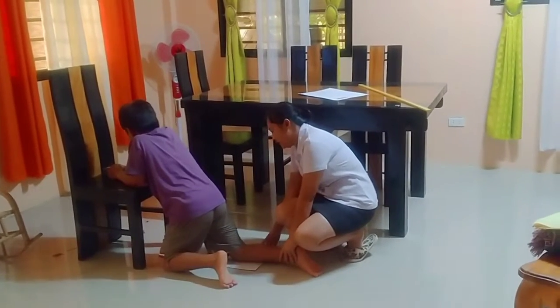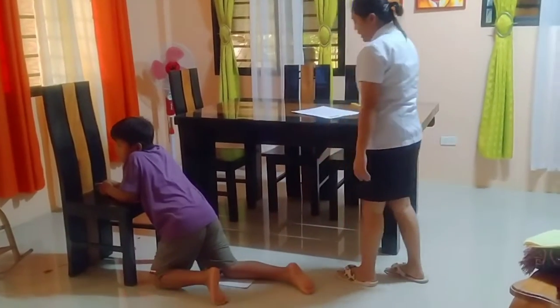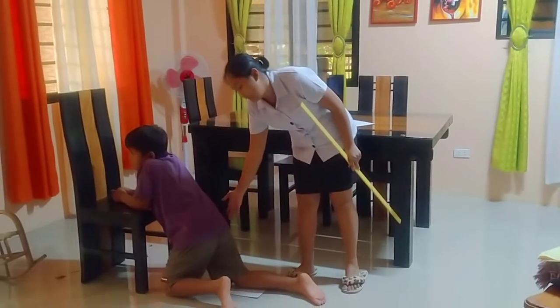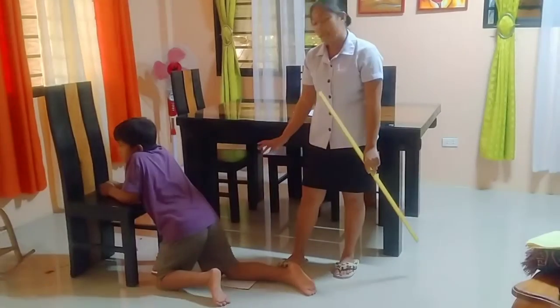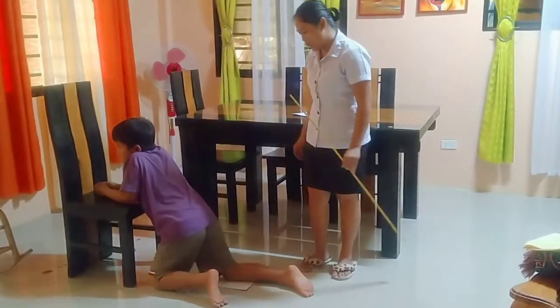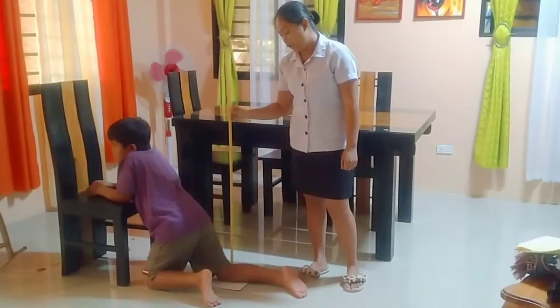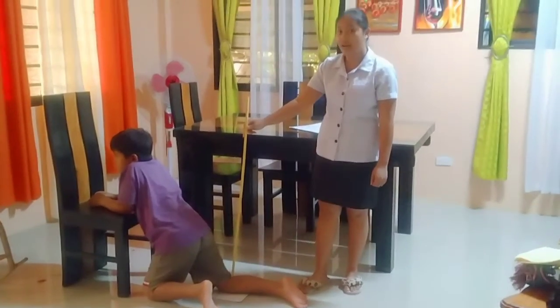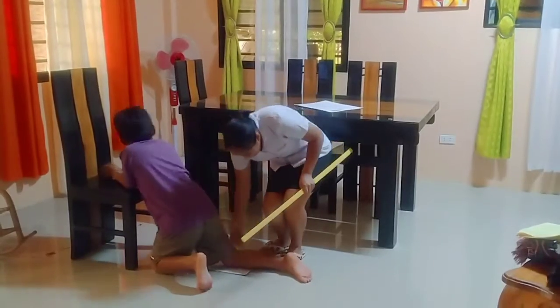Naka-center po ang knee ng ating pasyente. Now, as you can see, the femur of the patient is at 70-degree angulation. The central ray will be perpendicularly directed to the lower leg. Ayan. Okay. Relax.